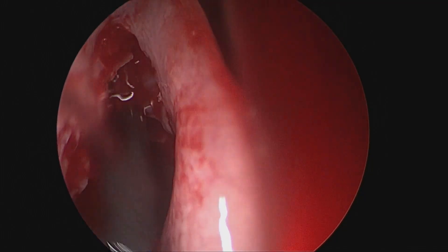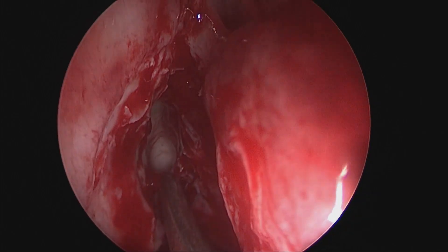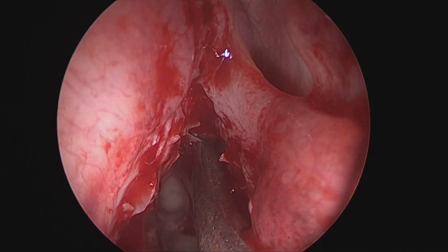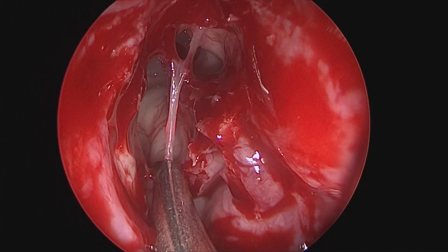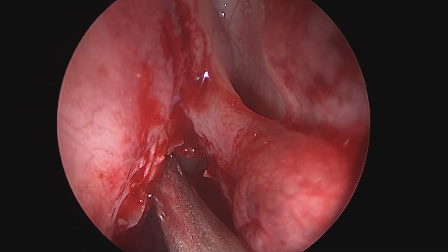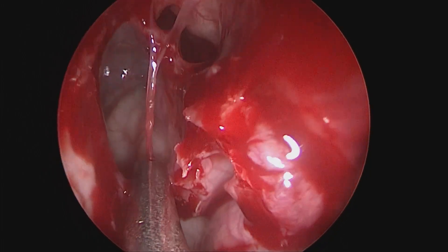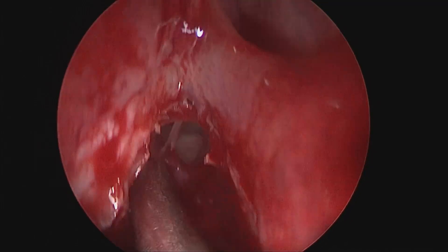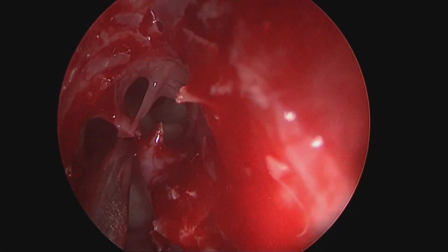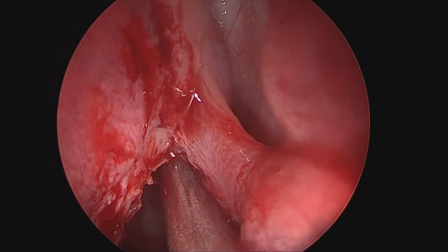There is one more cell medial to the frontal sinus, akin to the interfrontal sinus cell, which opens here and will soon need to be cleared. This is the interfrontal sinus cell shifted more on the right side in this patient. The trajectory of the interfrontal sinus cell goes medially, while the frontal sinus proper is oriented more laterally, with a party wall between the two cells which can be broken down using a suction curet or a normal frontal sinus curet.